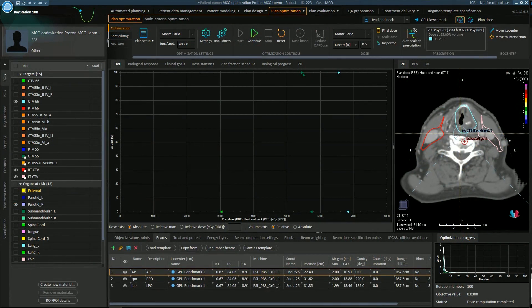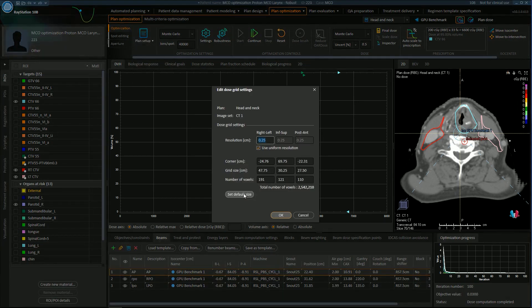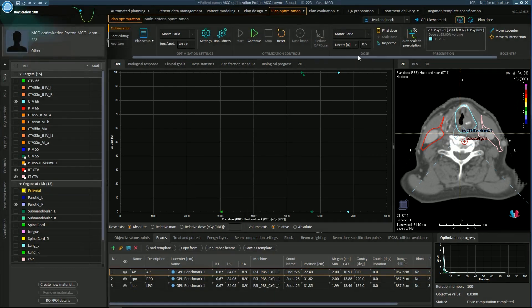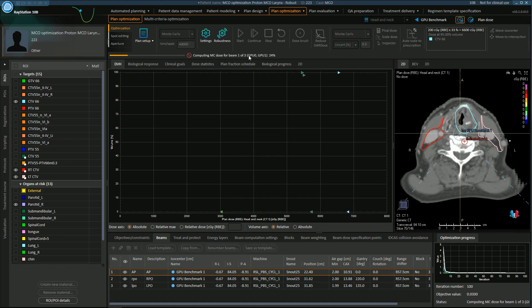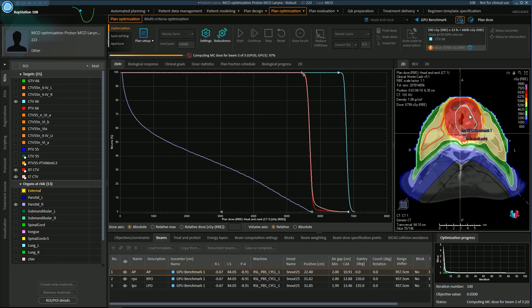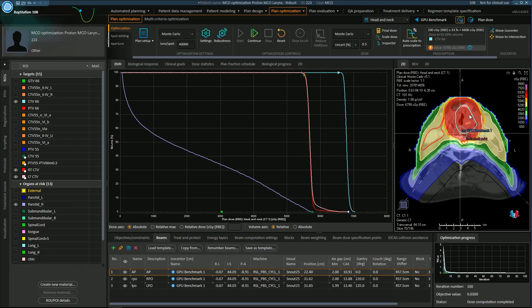In RayStation 10b, we're excited to release dose computation on the GPU for our Proton PBS planning. Here I have our head and neck case. My dose grid setting is 0.25 and I have an uncertainty of 0.5. When I press final dose, you'll be able to see the GPU calculating in about five seconds. The speed of this calculation is great because it means you can plan patients even faster and spend more time making the best possible plan rather than waiting for dose calculation.